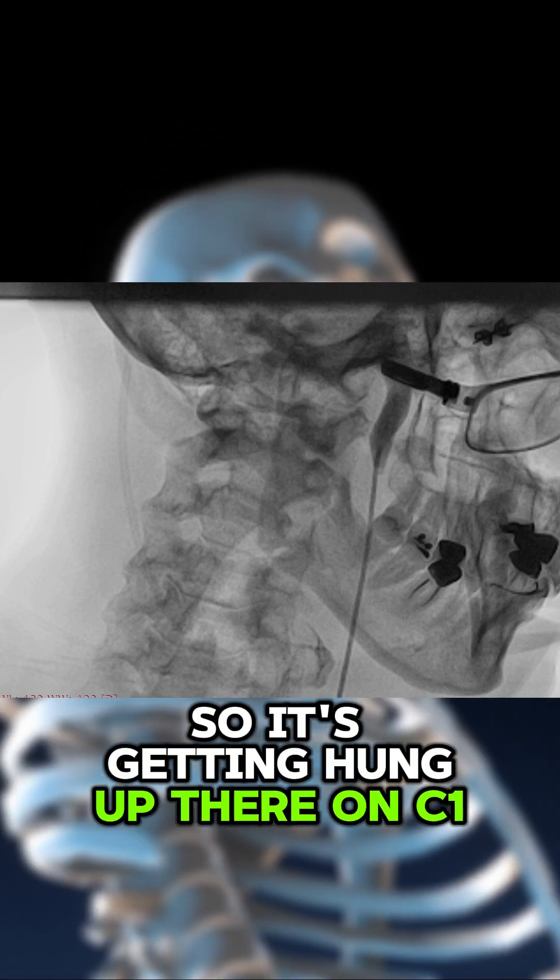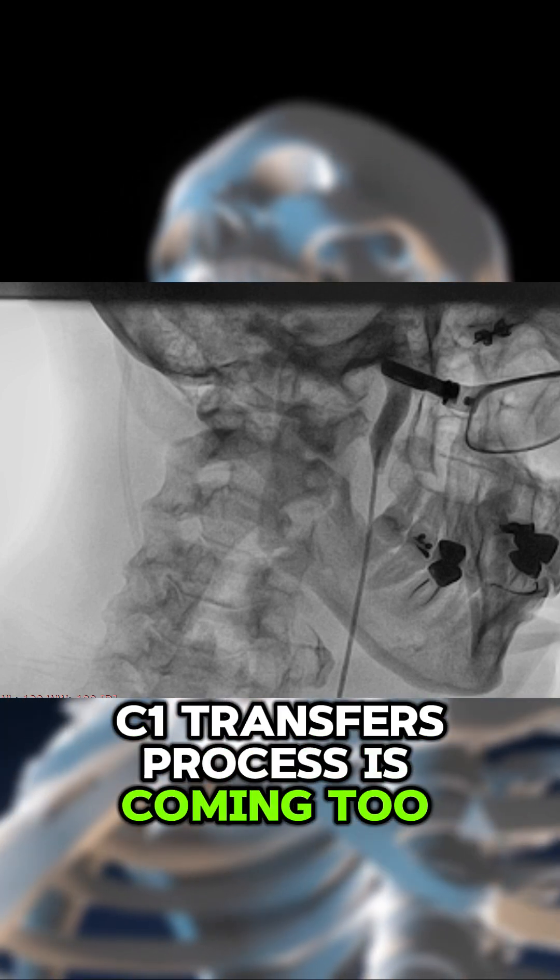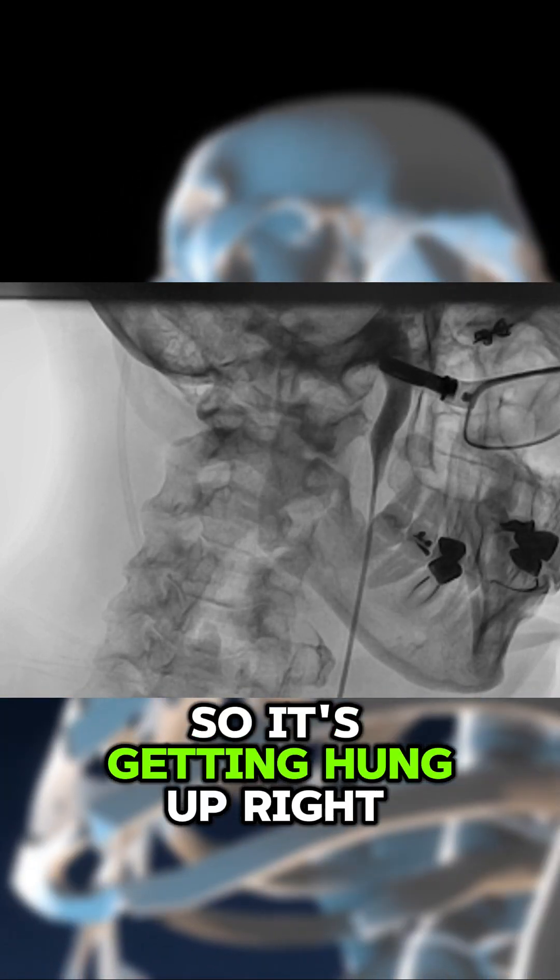So it's getting hung up there on C1, and that's because of the C1, C2 instability. The C1 transverse process is coming too far forward, so it's getting hung up right there.